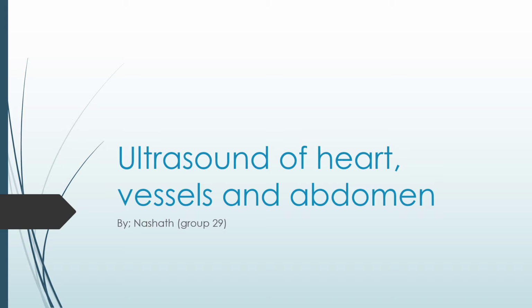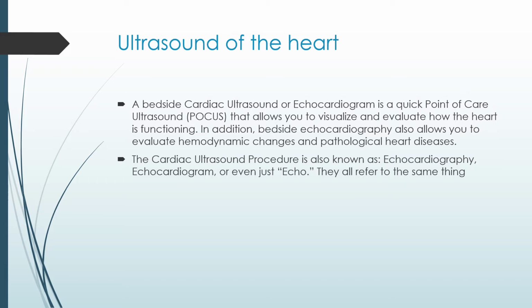Today I'll try to talk my best on ultrasound of heart, vessels and abdomen. When we look into the ultrasound of heart, what exactly is this? A bedside cardiac ultrasound or echocardiogram. This is a quick point of care ultrasound that allows you to visualize and evaluate how the heart is functioning.